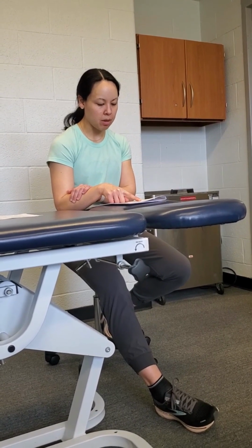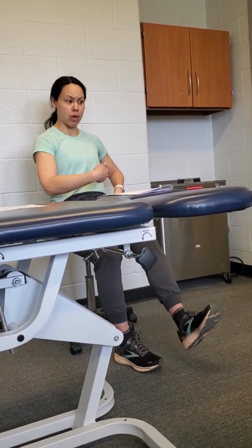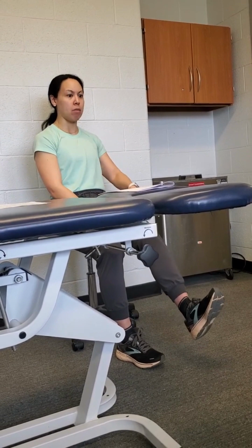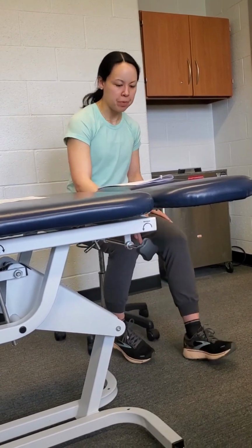So you would probably use the Premier Core, you think, and set them up, and you could do your isometrics at 90 and 60. The stim is on, right? And then they're doing their isometrics when the machine is on, and the BFR is just on. It's just on. Okay. Yep, exactly.